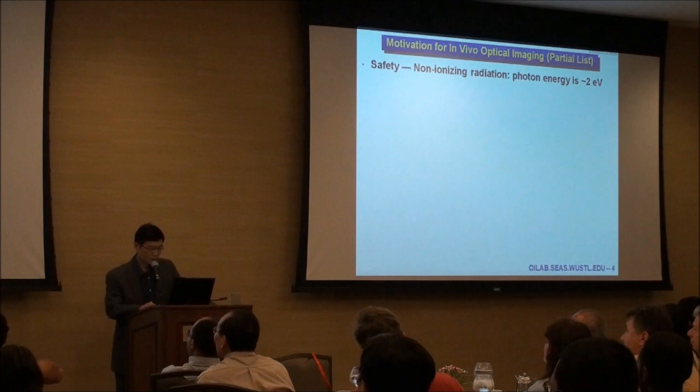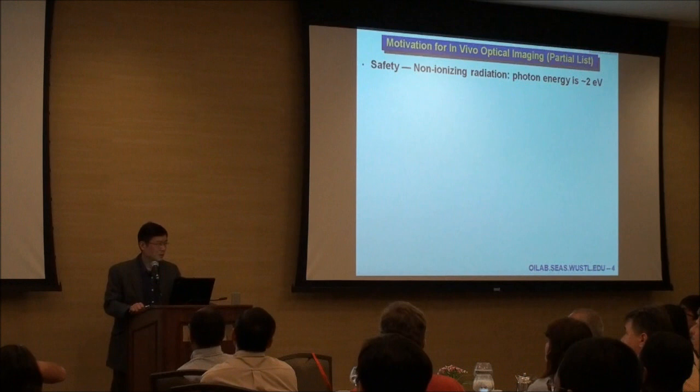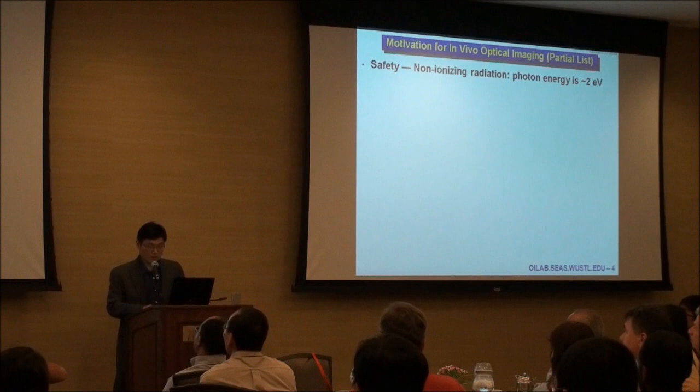Why optics? There are so many imaging modalities available. If you go to the radiology department, you'll find many. Optics is very unique. First of all, it's totally non-ionizing radiation. And the photon energy is very gentle, a couple of eVs. If we use X-ray, we're talking about thousands of eVs. So it's very safe to use light. I mean, we see light every day, even when you're asleep.